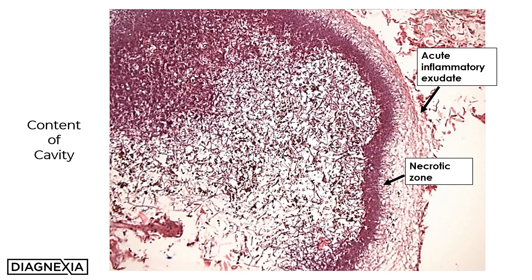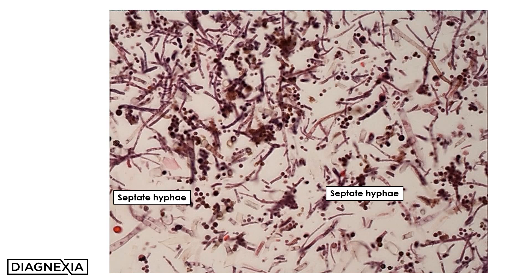There is a compressed necrotic zone sandwiched between the acute inflammatory exudate and obvious fungal elements which are seen centrally. Under higher magnification, one can see these brown pigmented fungal elements, both spores as well as hyphal forms.